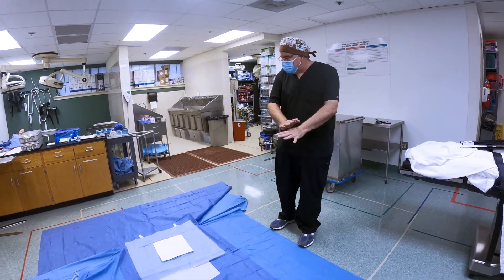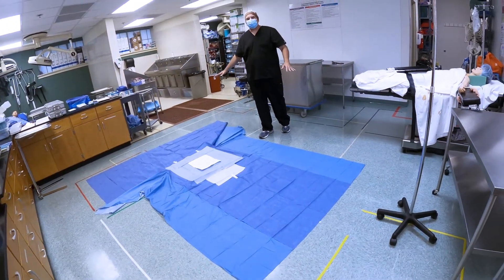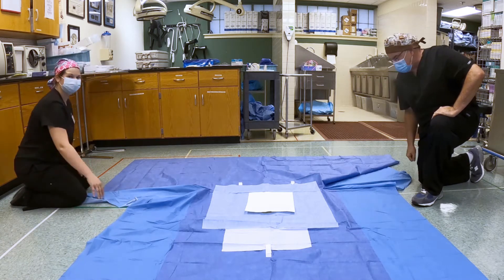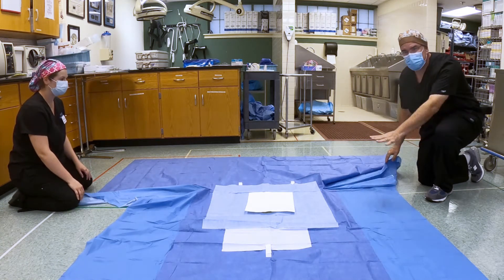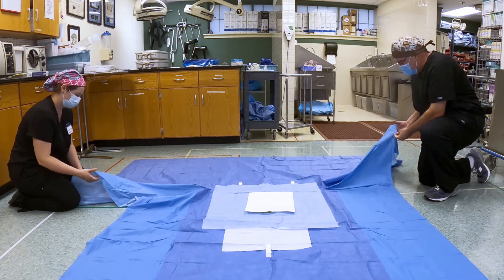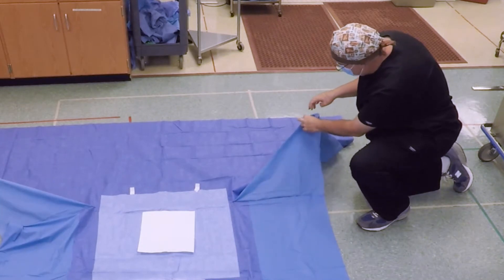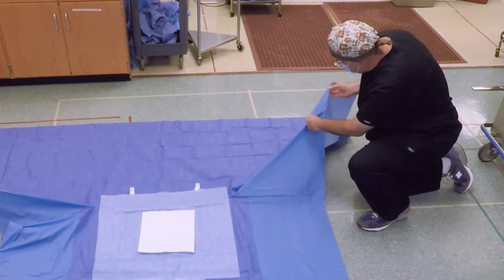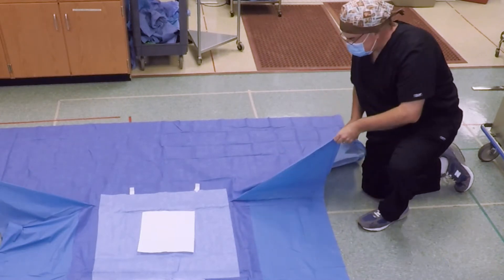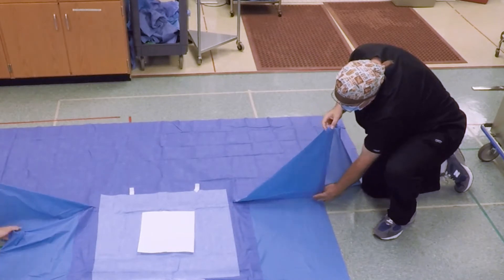The first thing you do is spread out your laparotomy drape on as large a floor surface as you possibly can. To do this, you're going to need a partner to help you. Stretch out the laparotomy drape as long as you can — you're going to find that these creases are your friend. Notice this first diagonal crease right here. Pull this all the way up to the diagonal crease and fold it down so that this line here is perfectly horizontal.